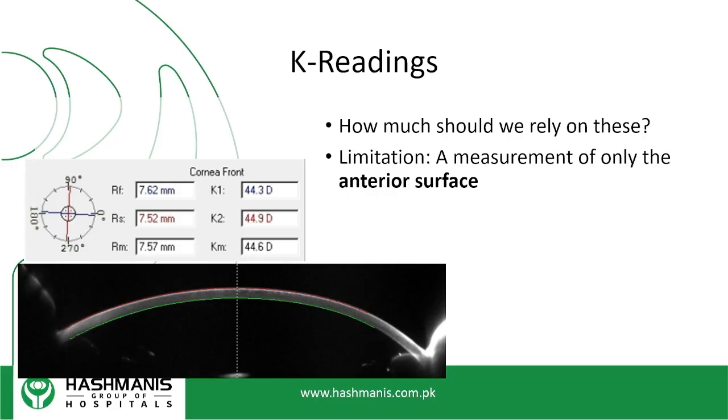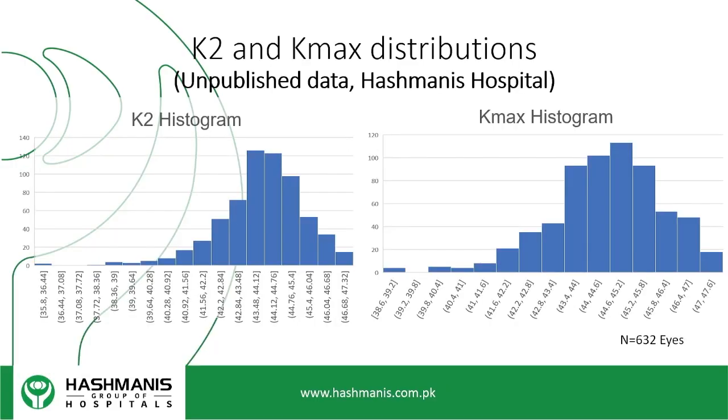I've seen many cases being referred with K readings that are high, and they've been diagnosed as keratoconus. You do the Pentacam, and they're not actually keratoconus. So the K readings are not diagnostic, they're just a screening tool. And there's a huge distribution of K readings; we did this at our own center.